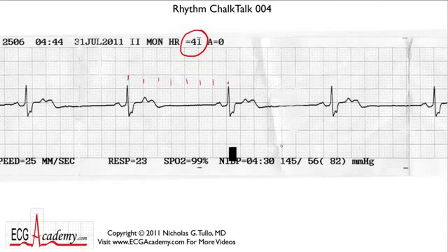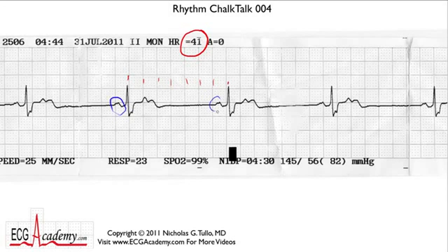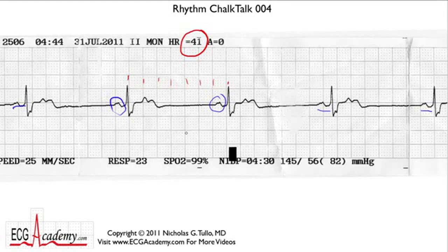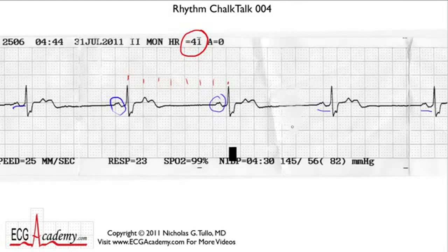Are there any P waves? We can see P waves — yes, indeed. If you look in front of the QRS complex, you see what looks like a normal P wave in front of every QRS. It's upright, and the PR interval measures about 180 milliseconds or so, which seems to be normal. So one of the more likely possibilities is that this is sinus bradycardia, which occurs commonly post-operatively. You'd be tempted to just say this is sinus brady and treat the patient accordingly.